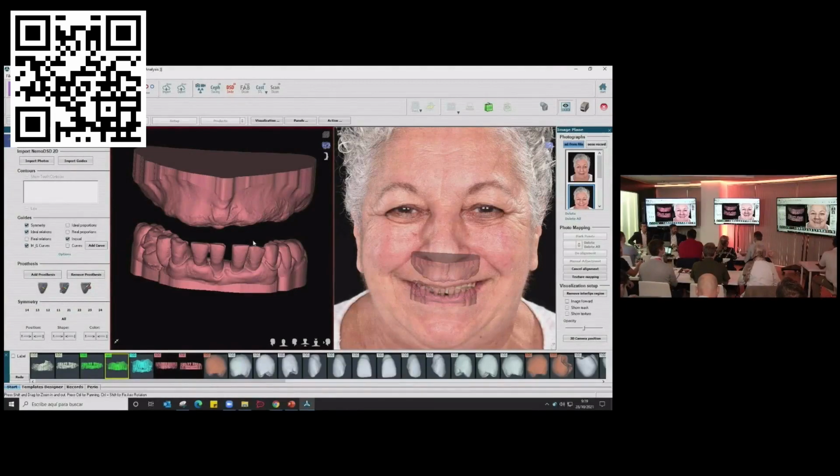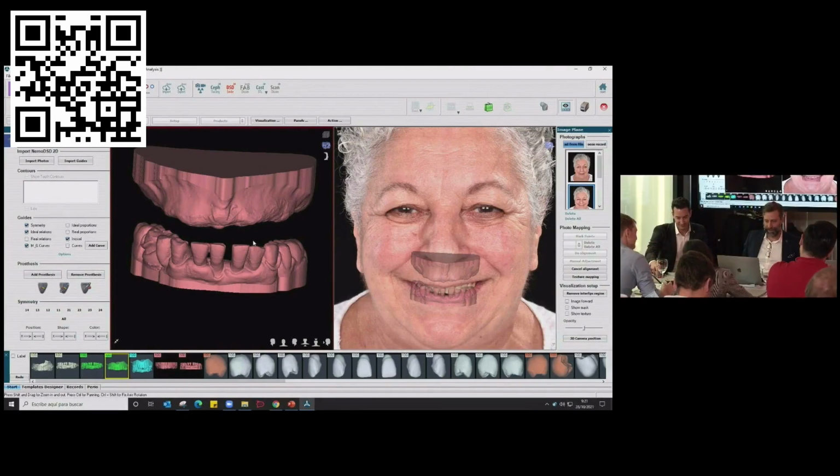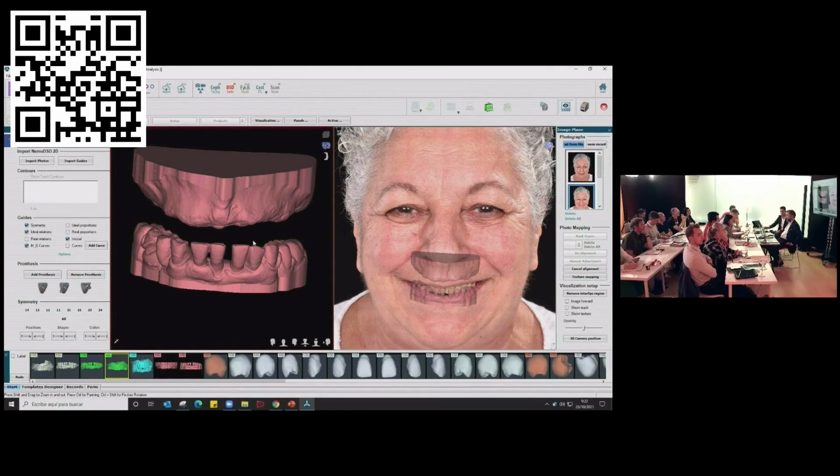Present you the patient that we're gonna do the surgery, how we planned her, and this one actually is a very favorable case also. You're gonna see it. But the most important here is for us to really make you understand why we do it this way in terms of planning, and the guides that we use, the click guide system that we developed, why we did it, and how we work with it, right? That's the most important. And it's the same for all the patients, right?